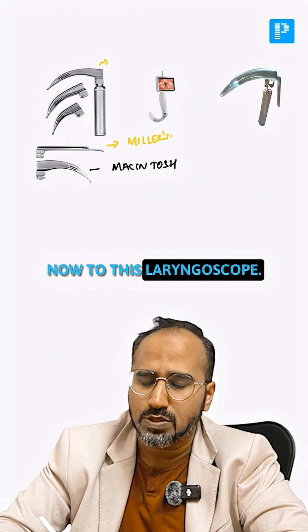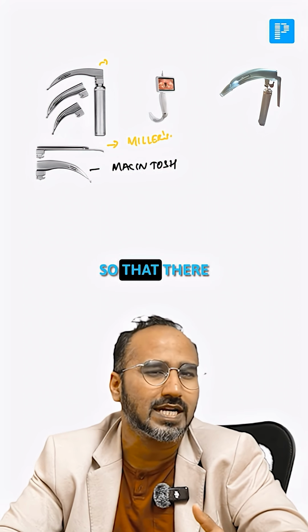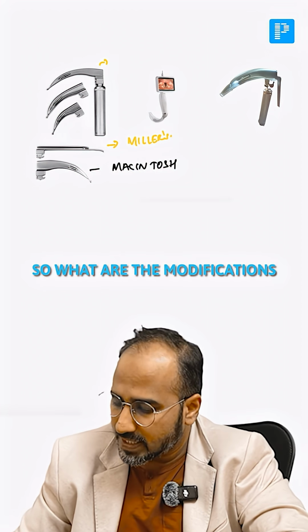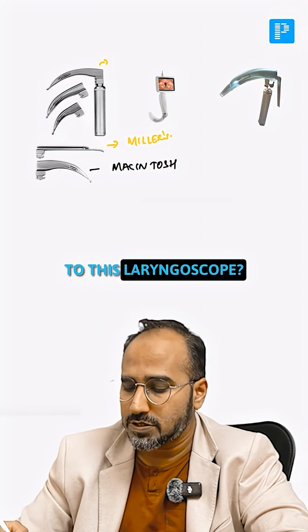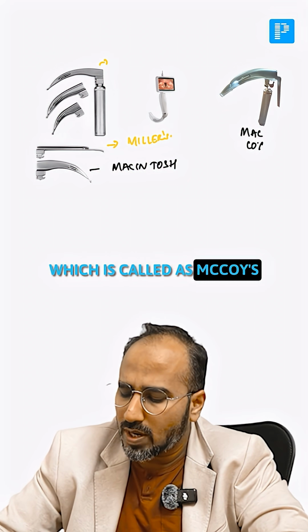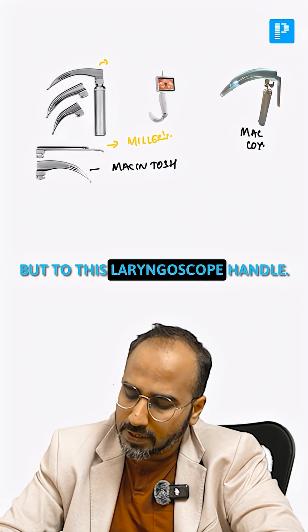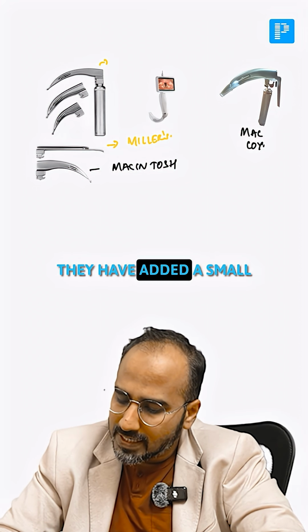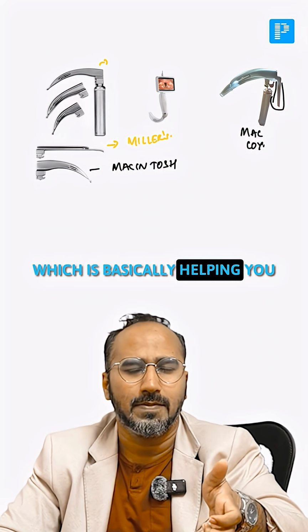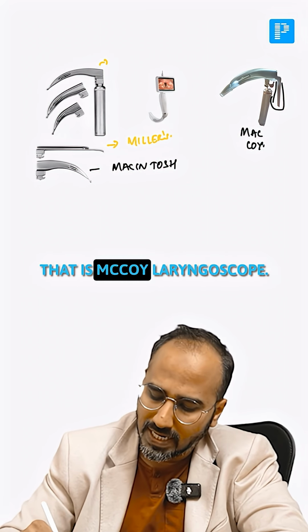Now to this laryngoscope, they have made many modifications so that you don't feel the difficulty of intubation. So what are the modifications done to this laryngoscope? There is one modified laryngoscope which is called McCoy's laryngoscope. You can see over here, McCoy is nothing but, to this laryngoscope handle they have added a small structure over here, which is basically helping you to lift the epiglottis as well as the tongue. That is the McCoy laryngoscope.